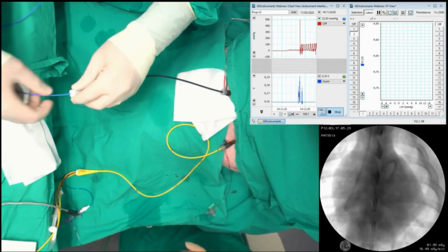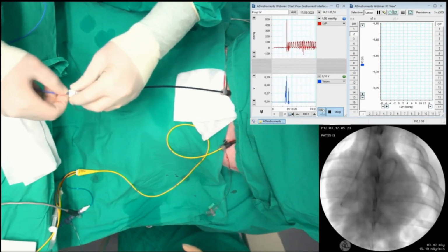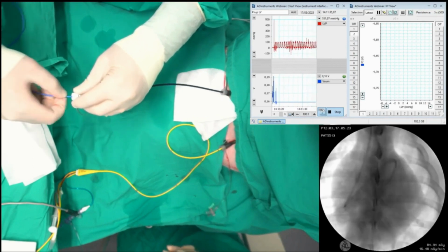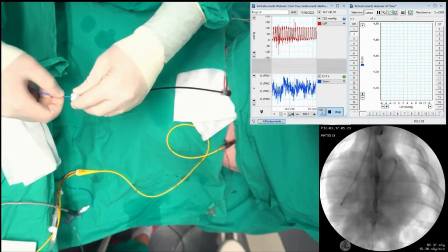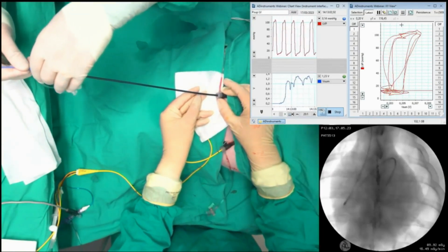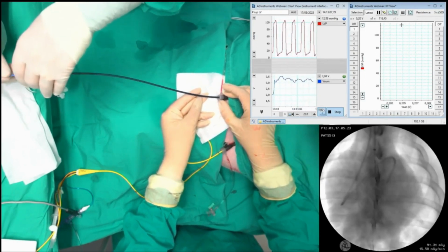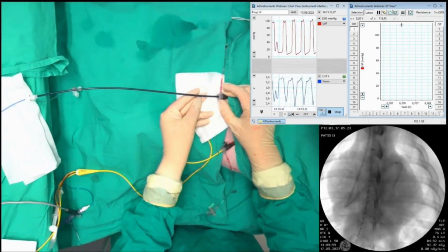And then similarly as before, you will see the volume segments coming down the catheter and then the pigtail forming after the radiopaque tip of the sheath. And you'll see that in a second. Here it is coming, and then you see the pigtail coming out of the sheath, and then you advance the ventricath, you pull the sheath out until you release all of the volume segments, and you pull the sheath all the way up to the ascending aorta. Then you adjust your ventricath position by pushing it a little bit more to make sure all segments are in and you're perfectly aligned with the major axis.